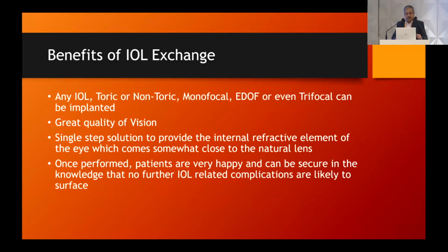And once performed, the patients are very happy and secure in the knowledge that no further IOL-related complications are likely to surface and that no further interventions may be required, as with explantation of piggybacks that happens sometimes.